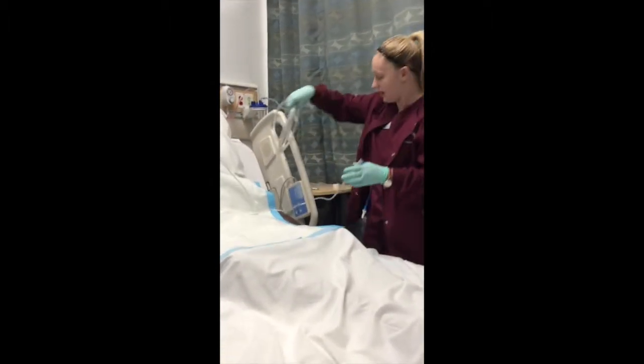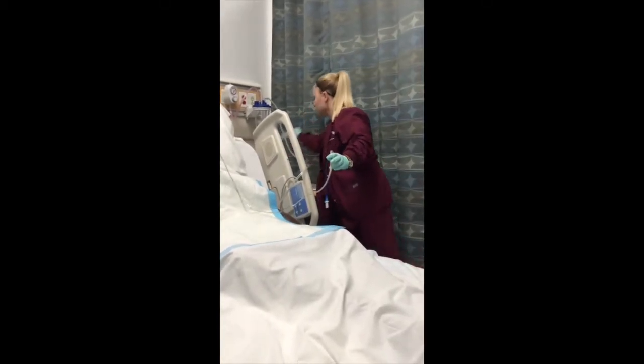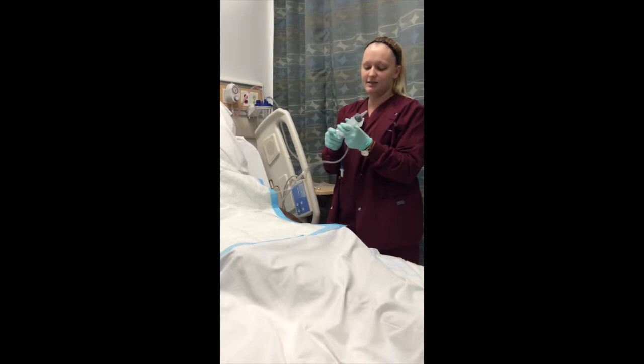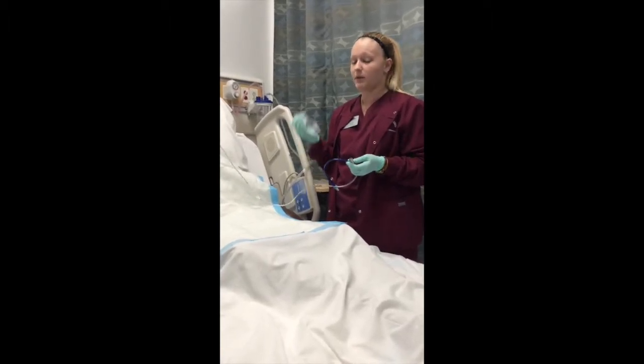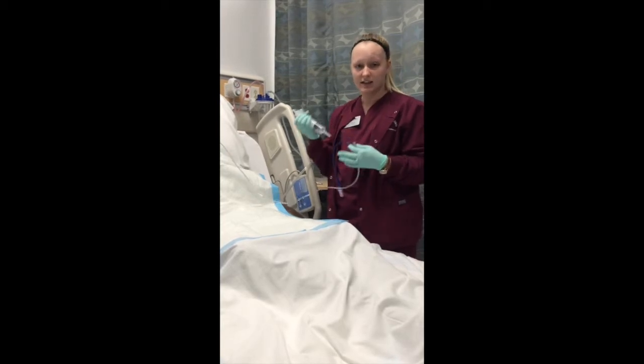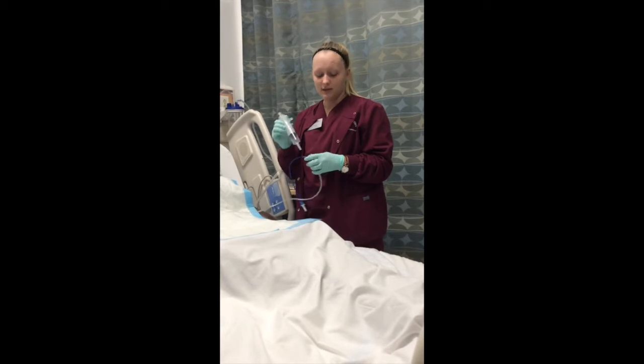I'm going to get the suction on, turn it on, put it right by the bed, and I'm going to grab a syringe and get some air in it, and this is to make sure that it's placed correctly. Of course, I'm going to want to get an x-ray before I put anything into this tube, but since I'm only going to be taking air out of it, I can go ahead and check placement this way.